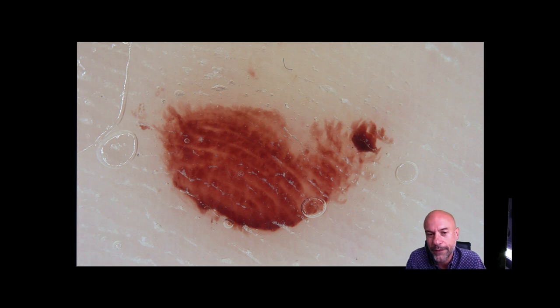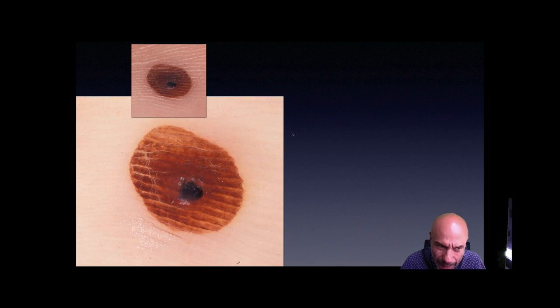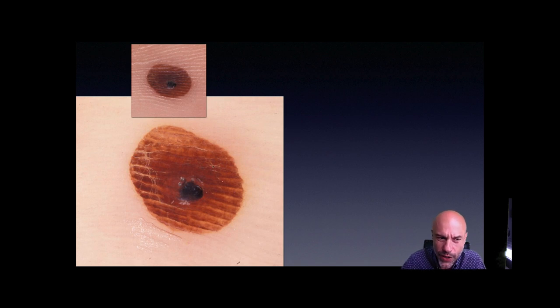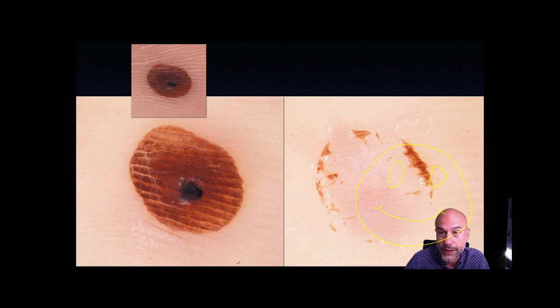Blood is usually easy to recognize — first of all because of the color. Red color means blood. Also peripheral blood spots. Sometimes, especially when the hemorrhage is not so fresh, the color becomes a little more brownish and it might be tricky. Of course the sharply demarcated border is always helpful. And remember that in case of significant doubt, it's quite easy to remove the keratin layer — the blood will disappear together with the keratin layer.